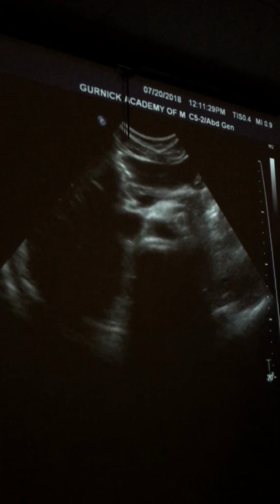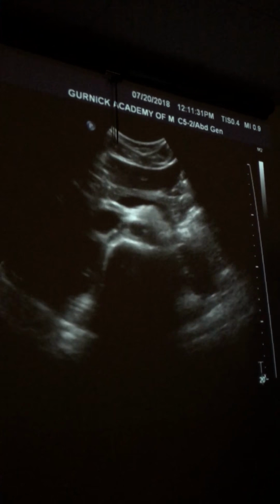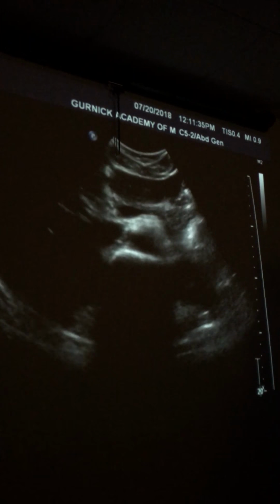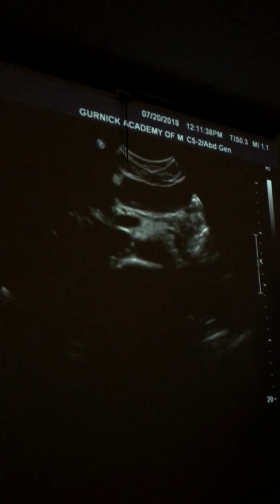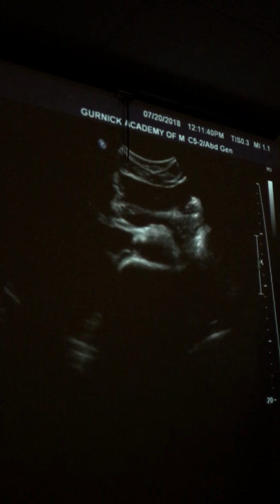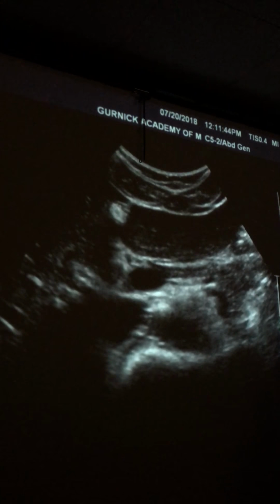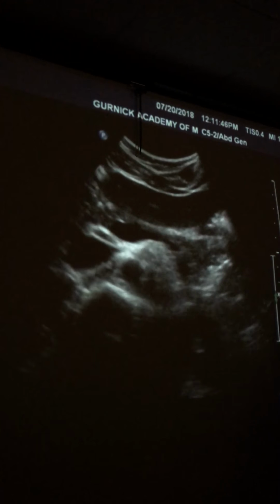What else have you guys been struggling with a little bit? So we know the splenic is the other half of the confluence. Nobody's confused about that, right? Do we do the celiac trunk? Do you want it as a longer shot, or is that fine? Do you want it all the way down the tail? Which view? This is okay, as long as you can point to it.